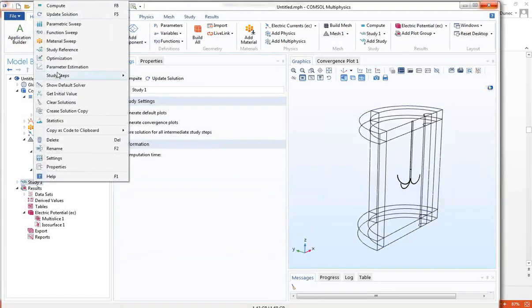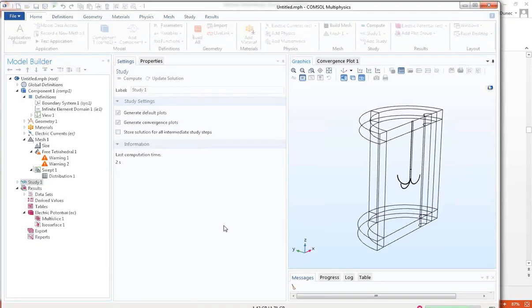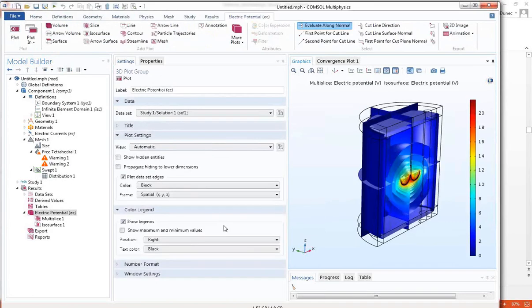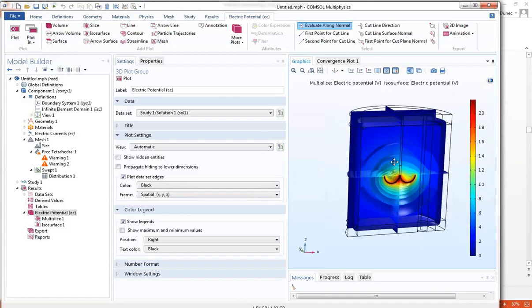Right click on study 1 and hit compute, and now it will actually avoid that distortion problem that I was worried about. Thank you, whoever that was. And if you look at it, you can see the infinite elements properly bending these things. It is essentially putting in exponentials for the shape functions right there. That's what I should have seen before. So thank you.